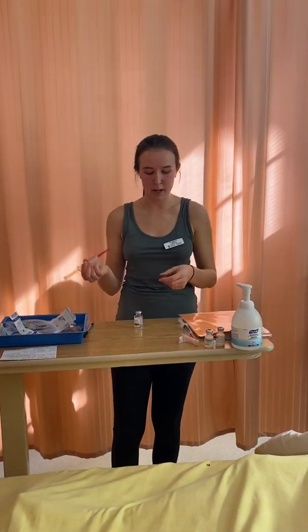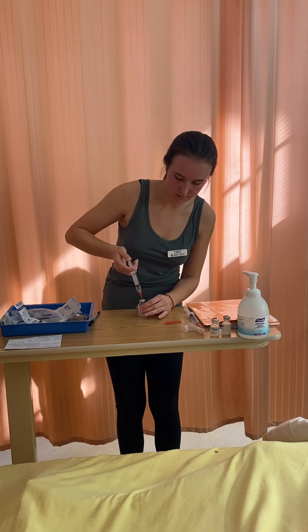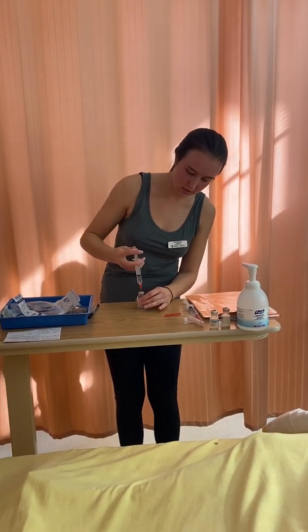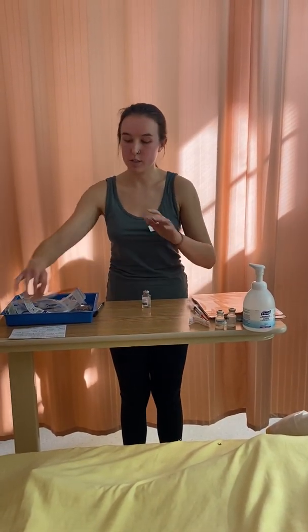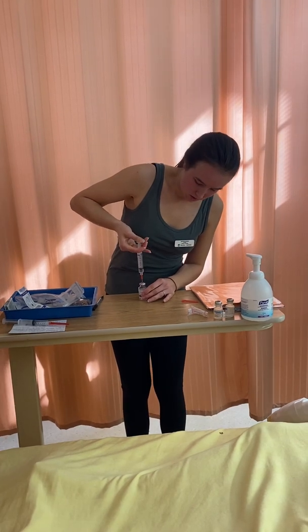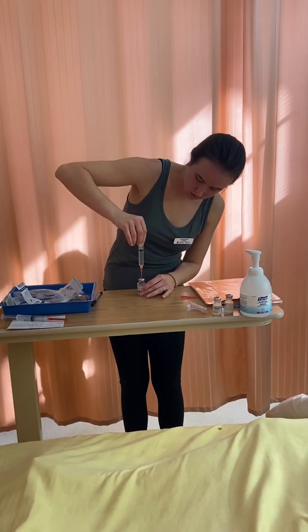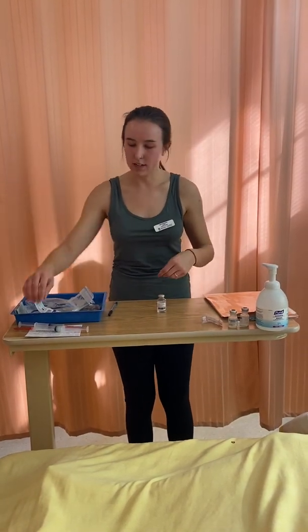Going into my medication vial that I previously cleaned, I'm going to inject my first syringe of sterile water, letting the air come back out to avoid splashing. I would dispose of this in a sharps container and do the same thing again with my second syringe, letting the air come out and removing it. In my hands, I'm going to roll my medication vial back and forth, allowing it to reconstitute. I would not want to shake the vial because this would introduce air. Now that it's fully reconstituted with no particles remaining, I'm going to take out my dosage.